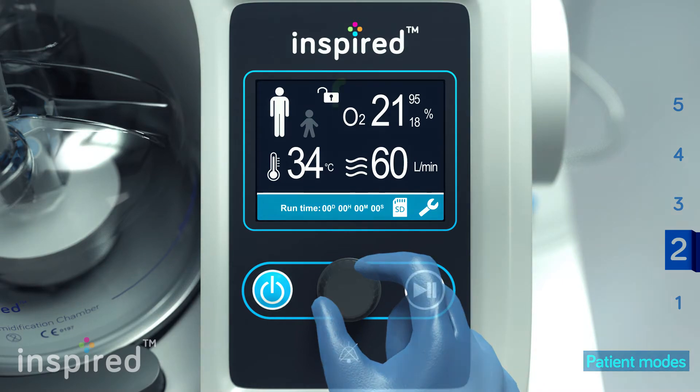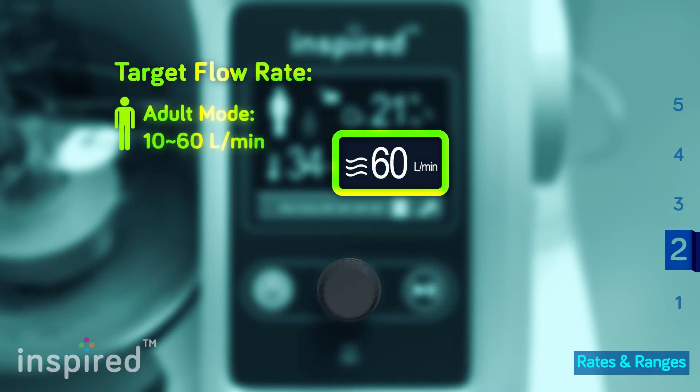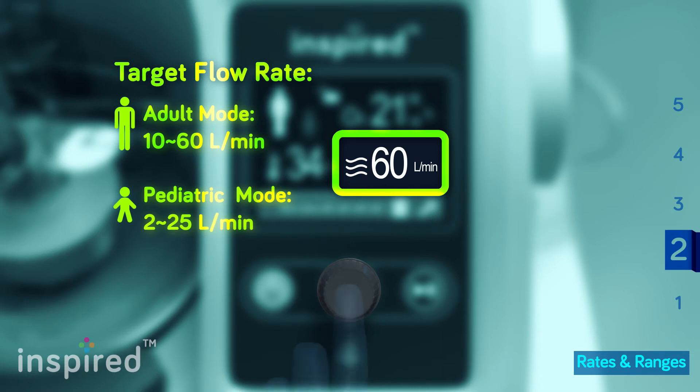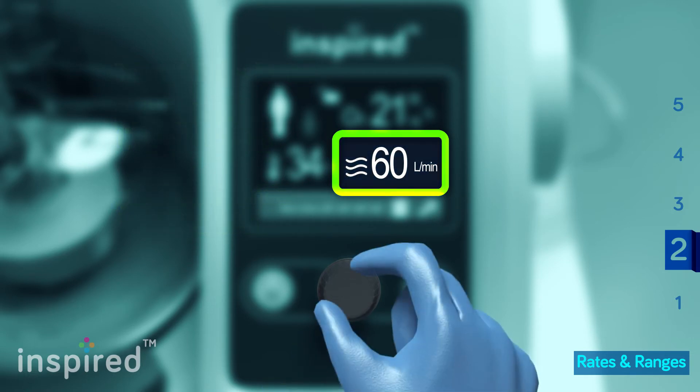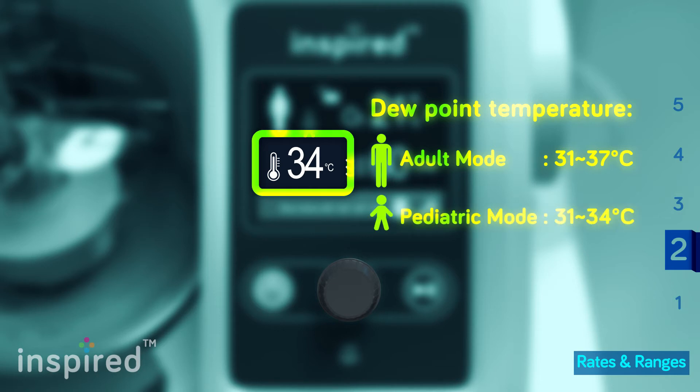Adjust the upper and lower oxygen concentration limits for the safety alarm. Set the target flow rate from 10 to 60 liters per minute for adult mode, and between 2 to 25 liters per minute for pediatric mode. Set the dew point temperature, which ranges from 31 to 37 degrees for an adult and between 31 and 34 degrees for a pediatric patient.